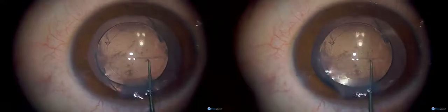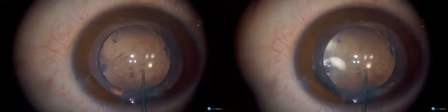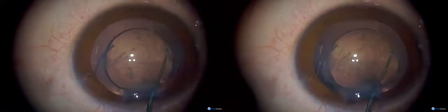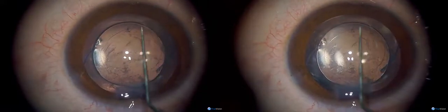Why put the IOL in first? Sometimes if you don't, what happens is the haptic of the implant can go into the vitreous. And now here is the posterior rhexis.